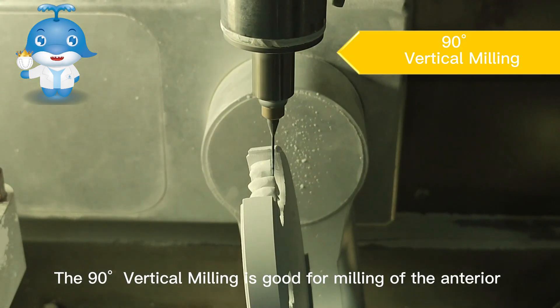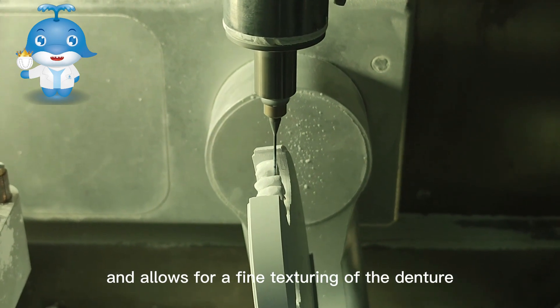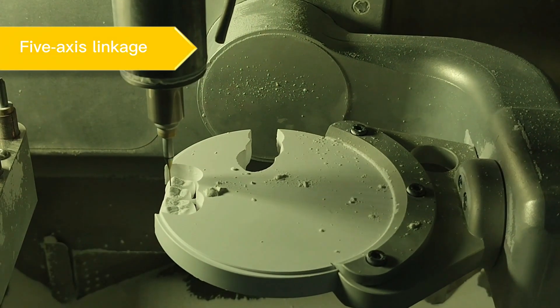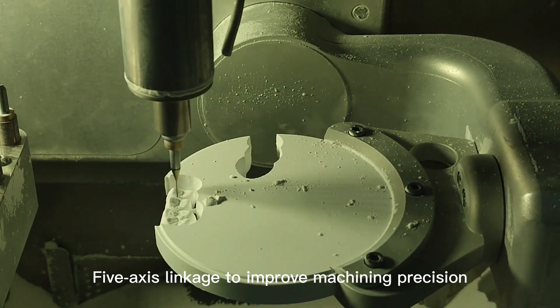The 90-degree vertical milling is good for milling of the anterior and allows for a fine texturing of the denture, providing the customer with a more perfect result. The five-axis linkage improves machining precision.